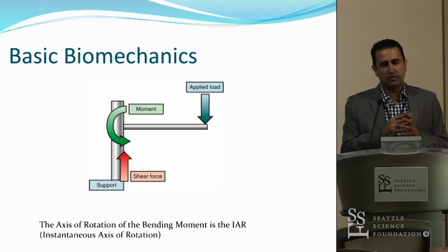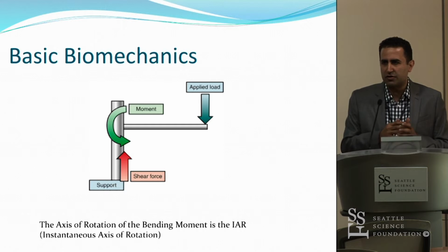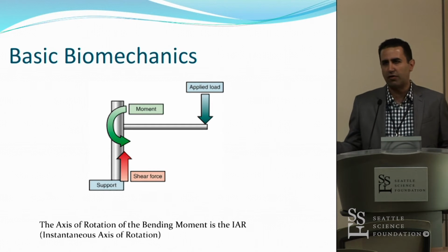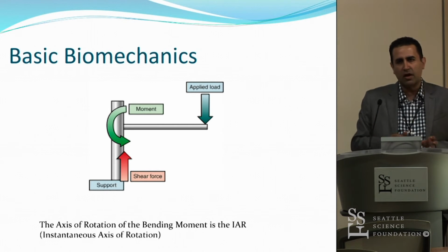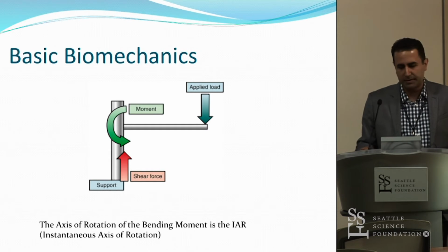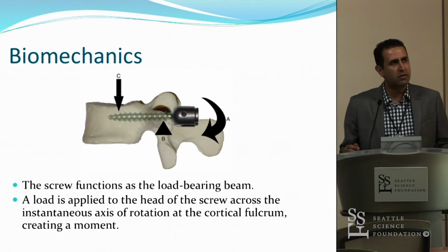And it's really important to understand this, and many of us don't really think about this until we're faced with a clinical situation where we can apply a force, if you like, a stress, in order to balance or correct an excessive applied force that, for example, leads to kyphosis in the spine. So following a traumatic fracture and so on, we can apply the principle of the cantilever to straighten out the spine, using instrumentation to achieve that balance, if you like. Is everybody clear on that? I think it's relatively basic, but it's something we need to think about.